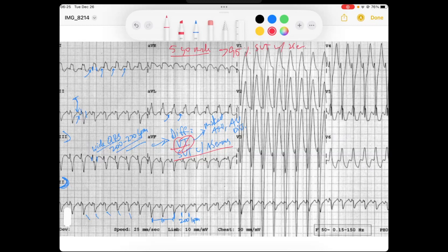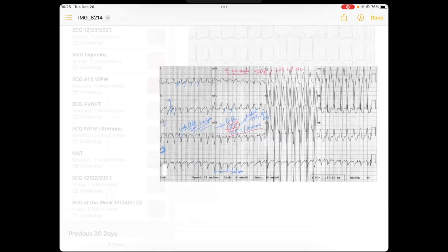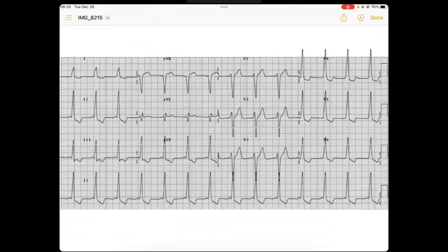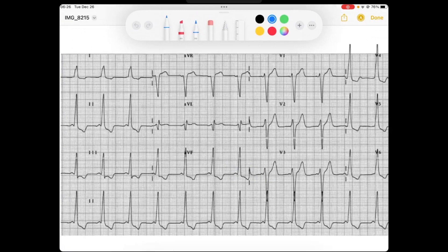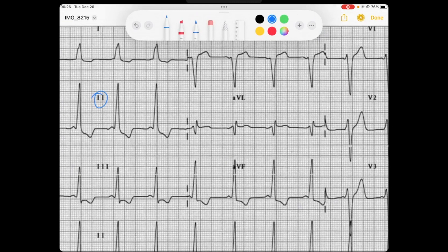You look through the computer real quick, and this is what you find. In lead two, we've got a regular rhythm occurring at maybe 90 beats per minute. We've got P waves here, but notice that the PR interval is really short, and it's got a little slurry delta wave.